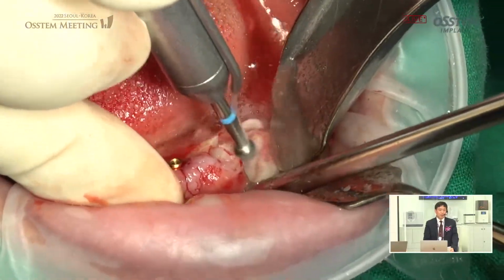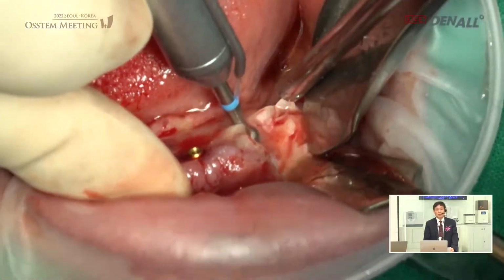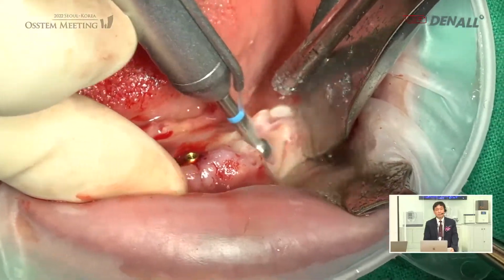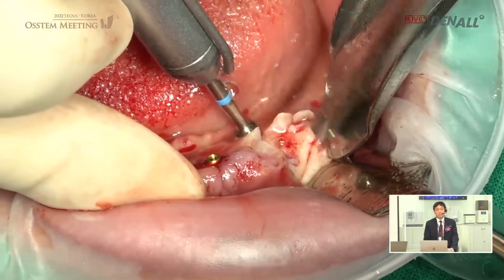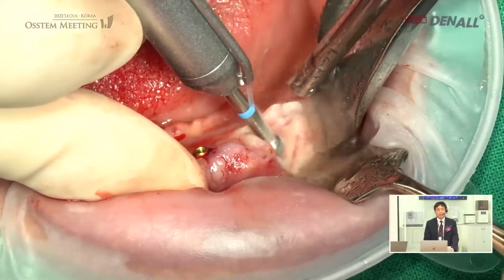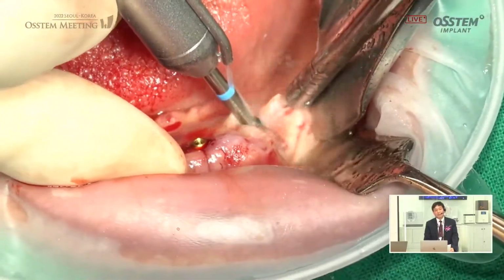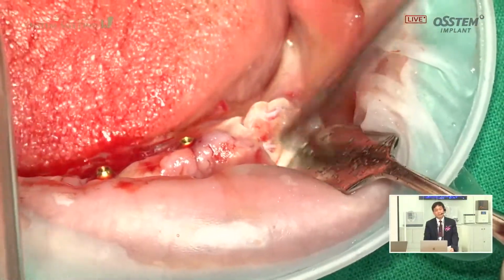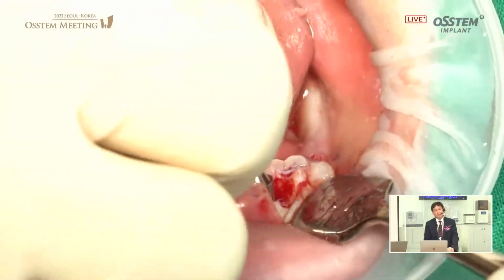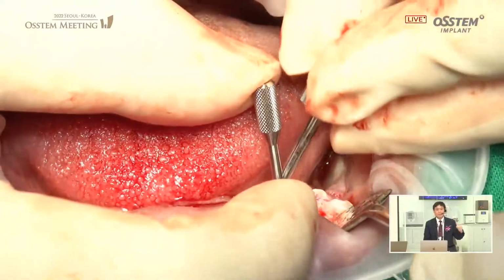The flattening drill is used to slightly flatten the tissue that is interfering above. Are you removing bone distal to the implant in this case? The anterior side is important, but the posterior side is also very important. In the posterior side, there is interference.